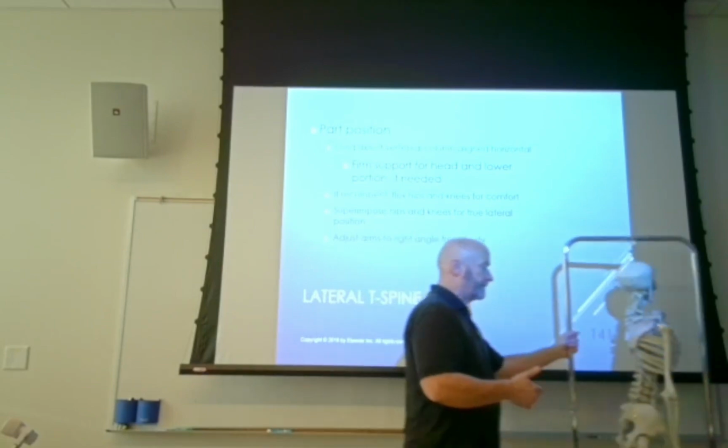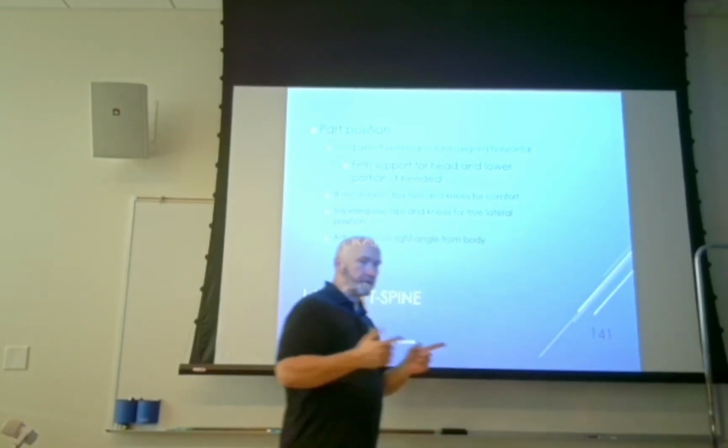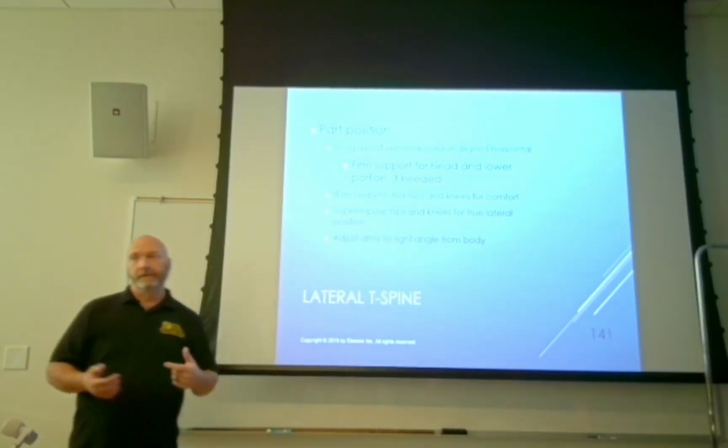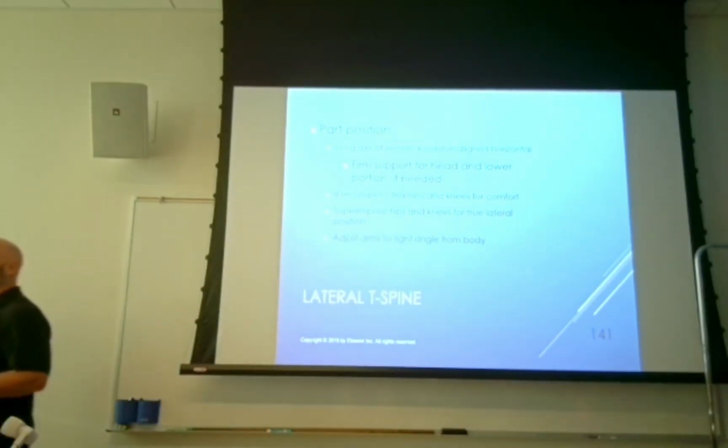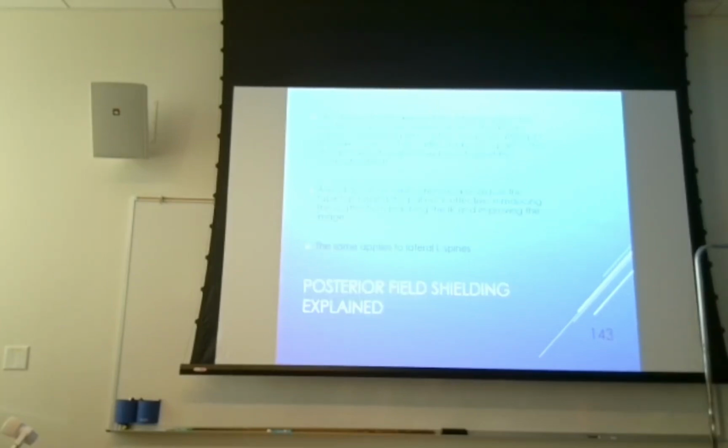We're going to do the exact same thing on the L-spine, but we're going to do it with slightly different angulations in the opposite direction. So not exactly the same thing. We're going to do something similar, I guess. Okay, so we'll talk about all that.